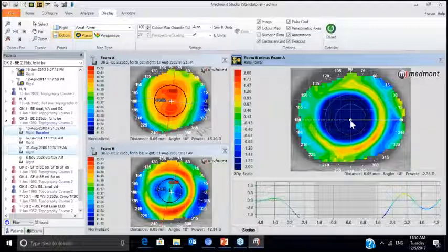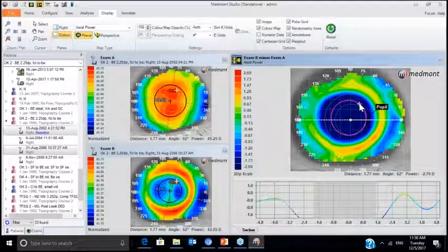And now you see in the center, we get 2.3 diopters of RX change. There's more effect in the center. We get this beautiful blue treatment area well centered to the pupil. It's looking like we're in good shape. So in Ortho-K, you don't have to do a refraction post-treatment because the topography will tell you exactly how much effect you created, as well as where that effect was centered.